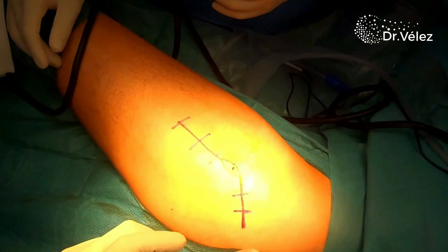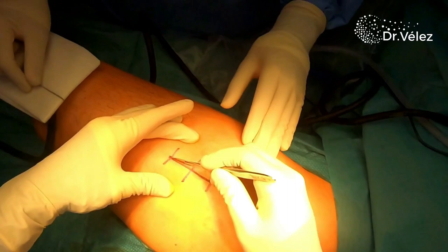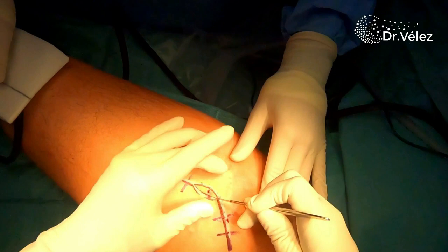So we go ahead and mark around a 15 to 20 centimeter approach with a soft curve to the posterior aspect of the gluteus maximus. We incise the skin directly with the scalpel and we work through the subcutaneous tissues and up to the fascia with electrocautery.